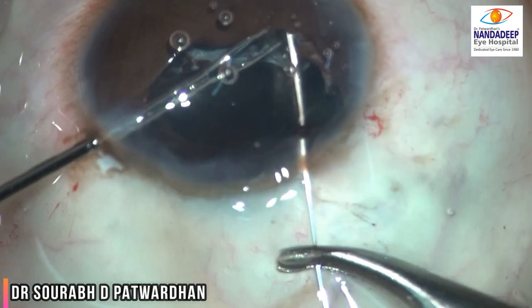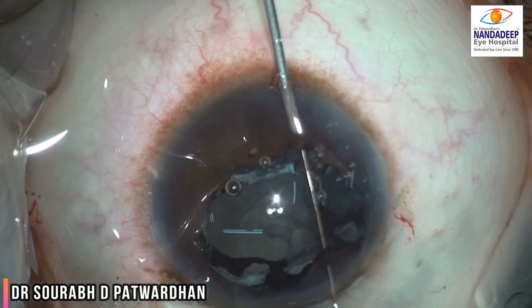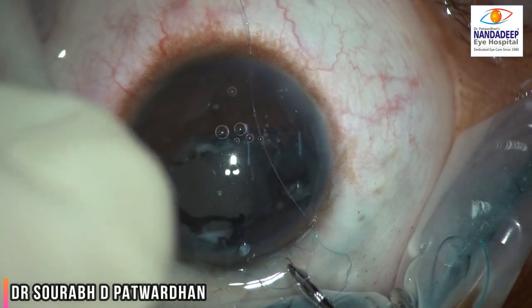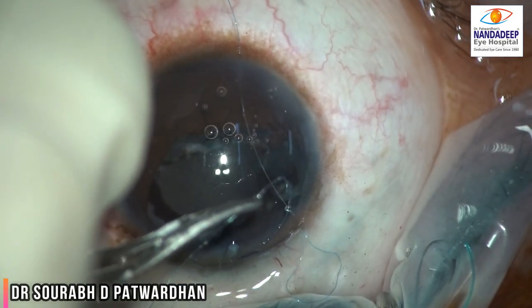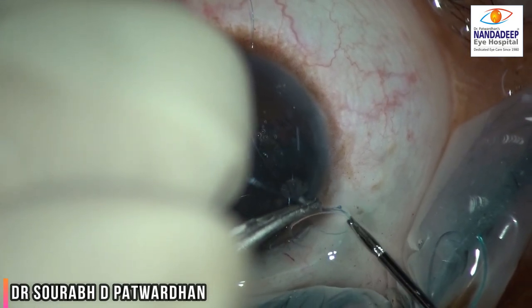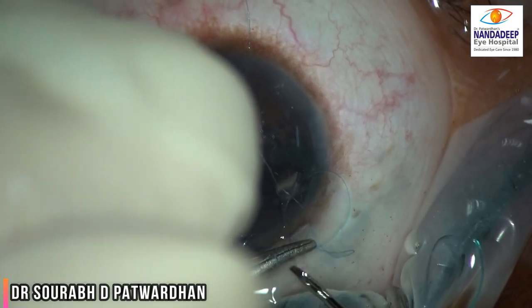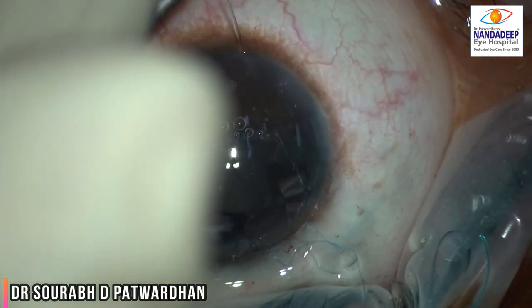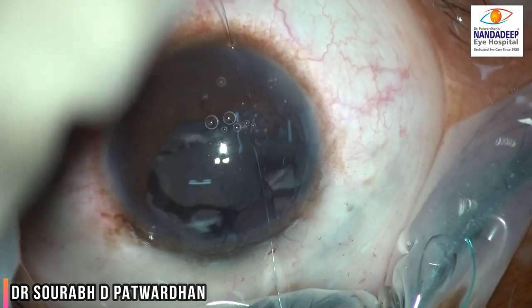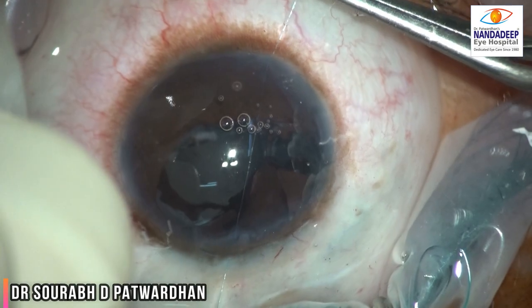By passing a 9-0 prolene suture, I am using 25-gauge end-opening forceps to manipulate the iris. Using the simple railroading technique with a 26-gauge needle, the thread was passed, then pulled back, and passed through the loop of the suture. I used the single pass four-throw technique here, then pulled the suture from both sides so the iris defect was reduced.